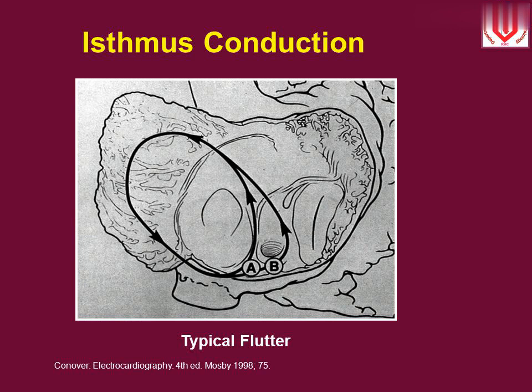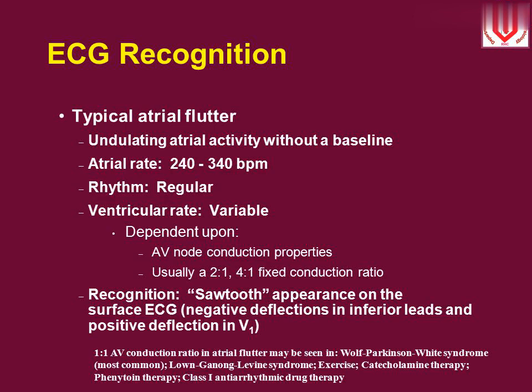Typical flutter. Reference: Conover, Understanding Electrocardiography, 4th ed., Mosby 1998. ECG recognition: typical atrial flutter.